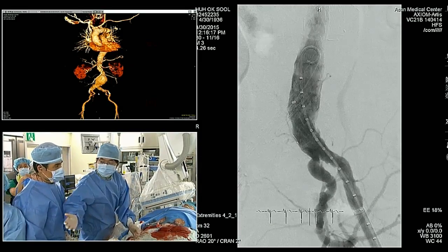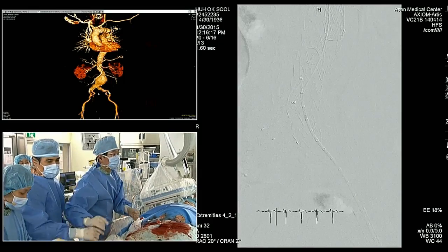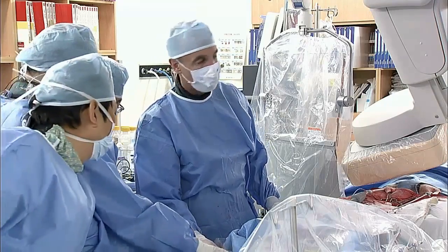And then while you're doing that, why don't we go over to the other operating room and see how they're doing? Thank you. Okay. And we can come back to you for your final. Hi, Bill. We're back. Hi, Bob. I got you.